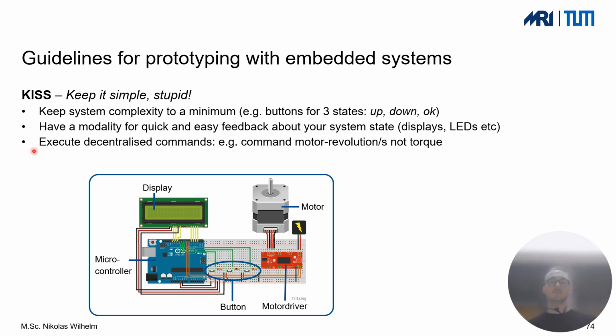So for example, if you have a motor, maybe in the end, what you actually want to set in your main code is just position that motor at a certain position or at a certain force that is being applied from the force sensor, etc. And you don't want to have everything being managed in the main code where you then start to set this kind of torque, or we set this kind of voltage now, because then this will have these and these consequences. So try to keep everything a bit more structured. Then in your main code, this will just be a simple line, motor dot perform 3 newtons, etc.